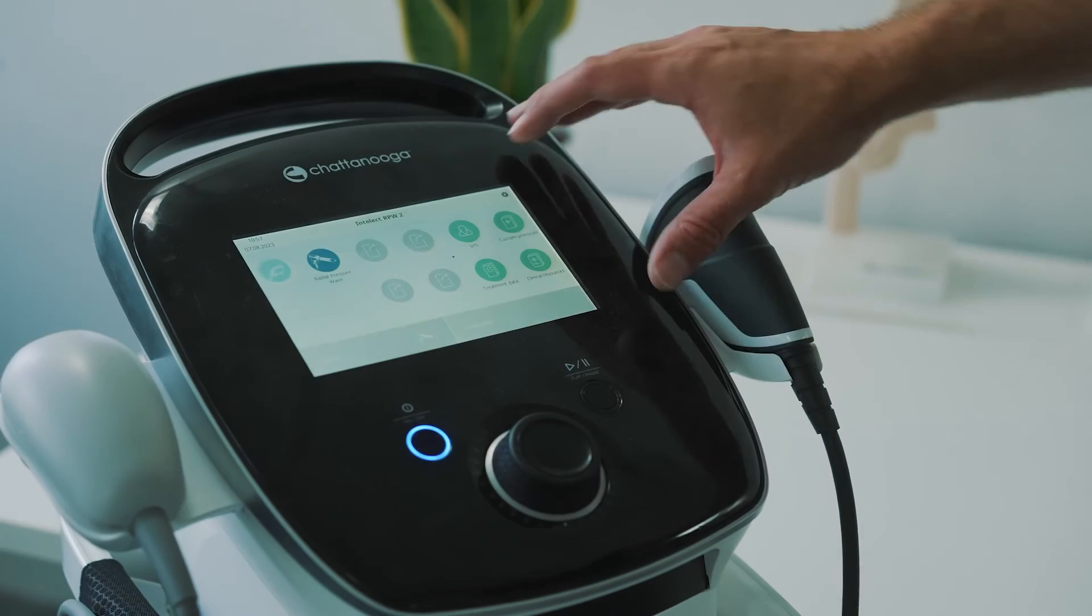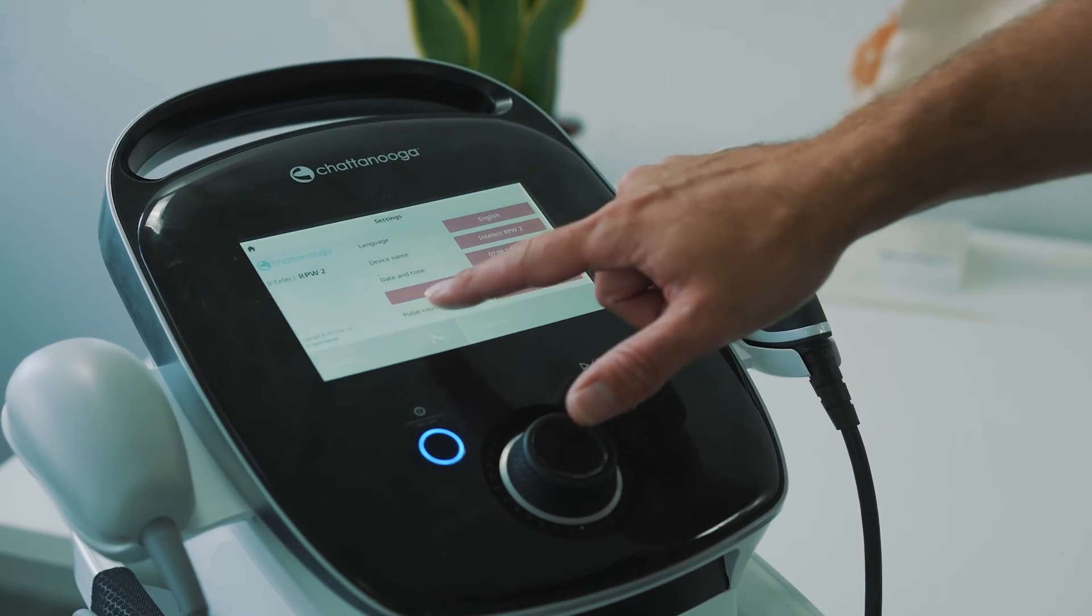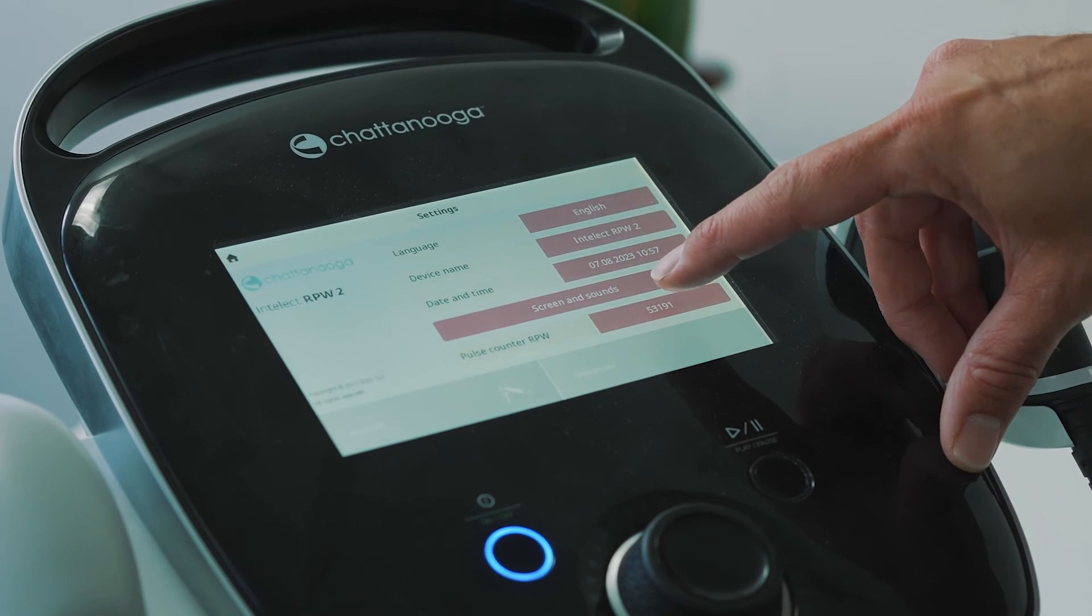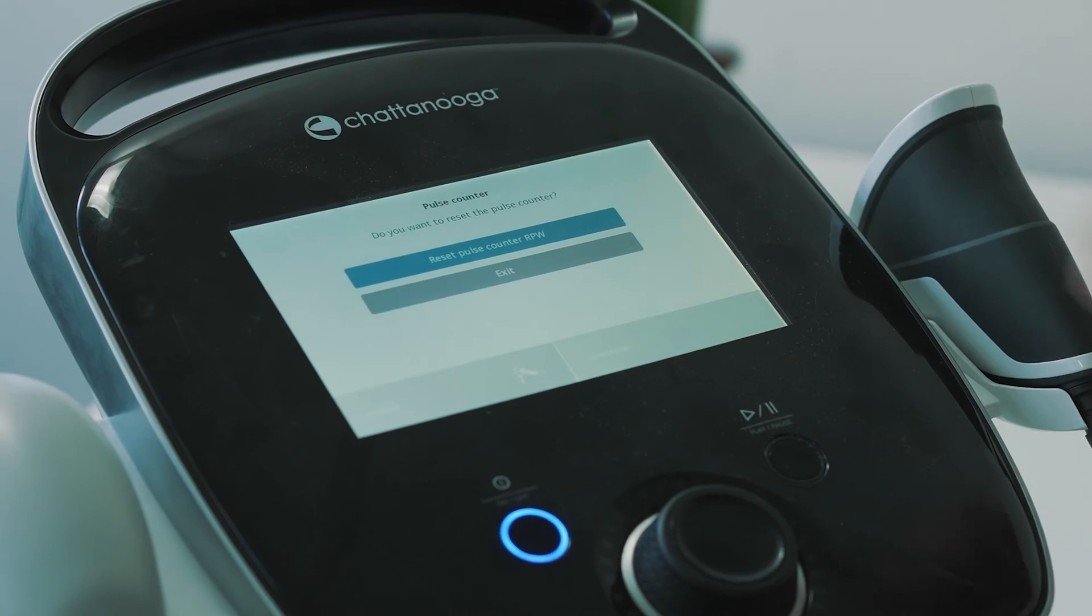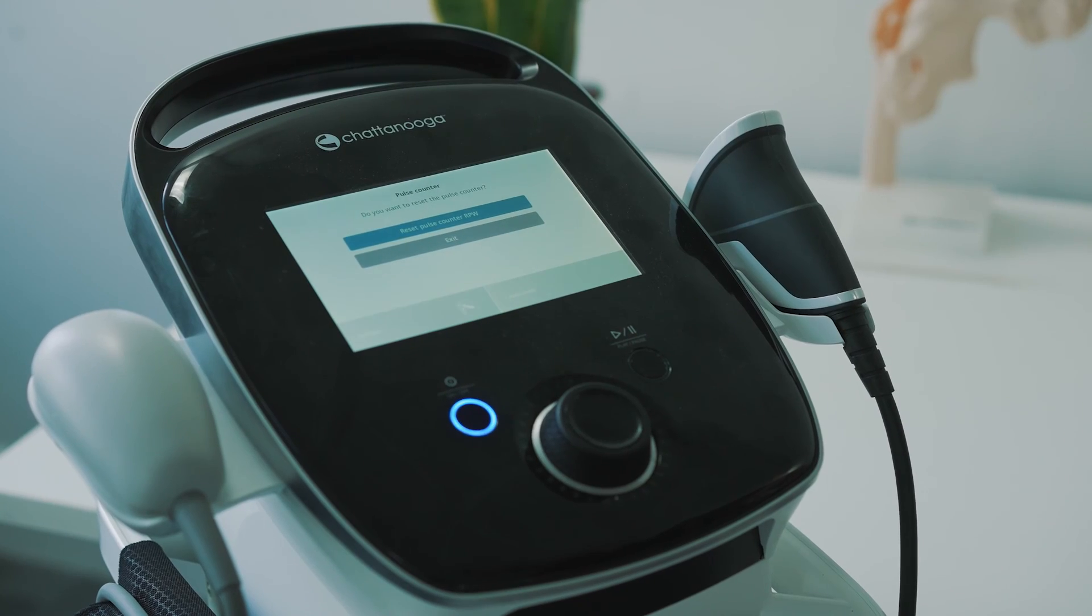To reset the counter, select the cog in the top right hand corner. Select the option where it says pulse counter RPW and click reset pulse counter. This will reset the counter to zero.